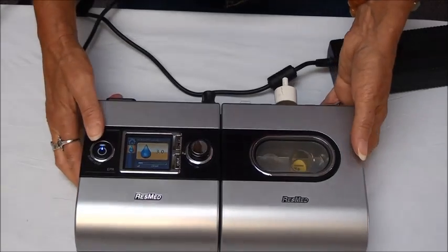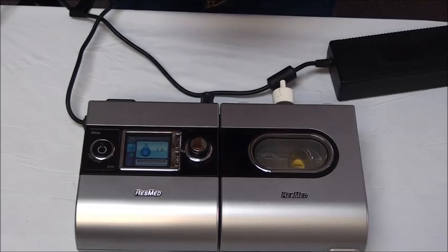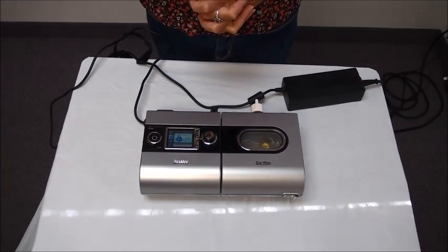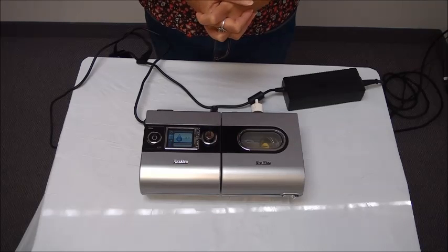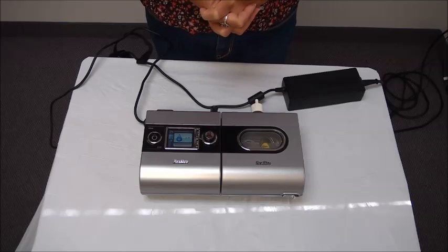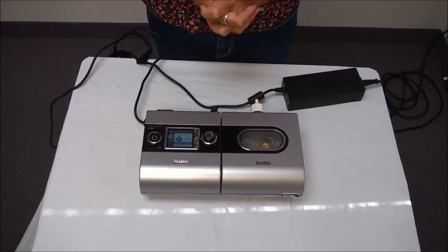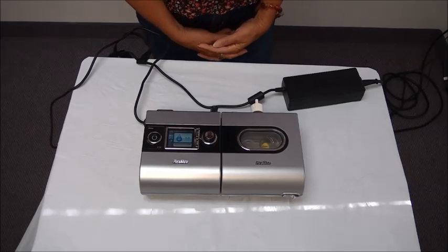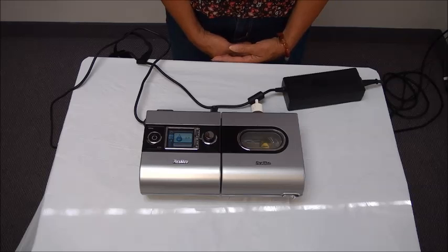The tubing and the different supplies you'll be using need to be cleaned on a regular basis. At a minimum you need to make sure you're cleaning your mask, your tubing, and your reservoir weekly. You can clean more often than that, but at a minimum wash everything in mild soapy water, rinse well, and air dry. When you need to order new supplies you can give us a call at Midwest and we would either ship them out or you can stop in and pick them up.